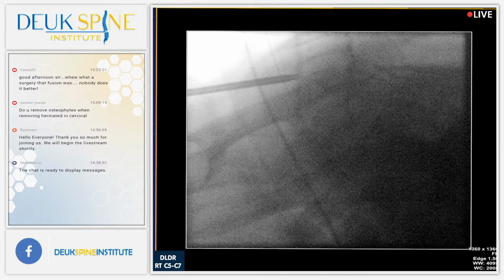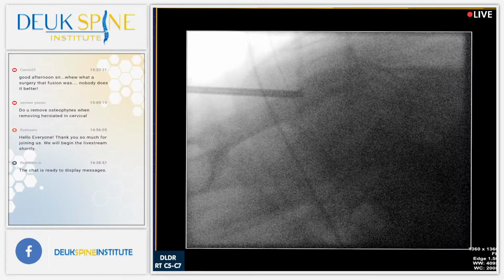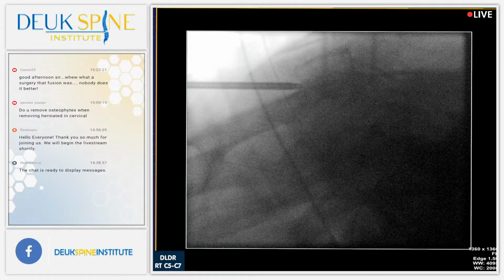I'm going to move south a little bit. Don't move, guys. Shot. Very hard to get there. Shot. Just a little bit. Let's get another AP, make sure I'm still in the middle. I don't want to come off to the side. That looks good. We're almost there. Poor man. It's not easy. This is probably one of the hardest ones I've done.